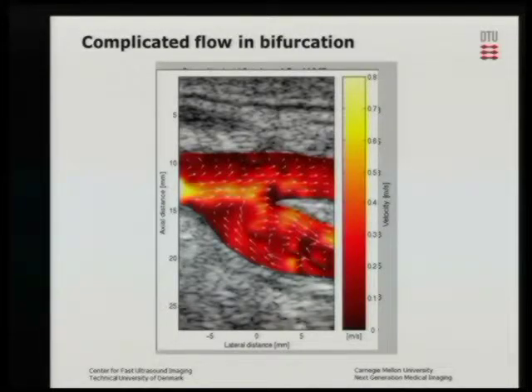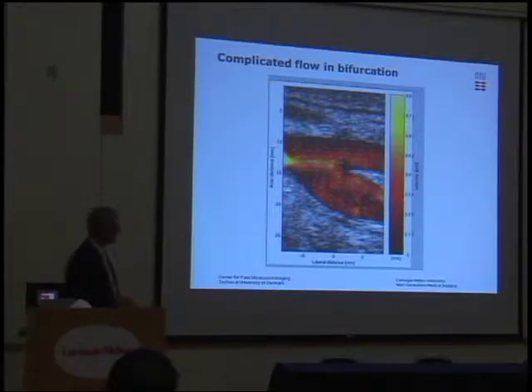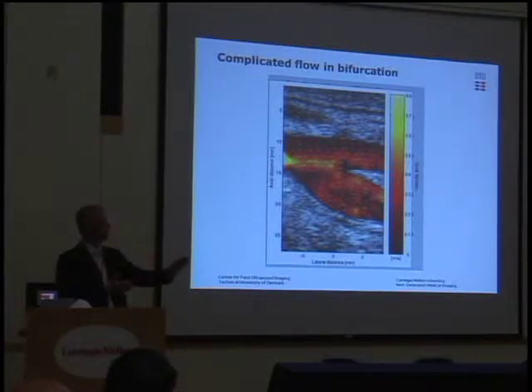So you see you have a fairly laminar flow on the top, and you have the vortex on the lower branch. And the problem of looking at this is really that this vortex comes in the systolic phase. It appears in 100 milliseconds, and then it races down the stream at 1 meter per second. So it's in the view for a fairly short time, and that's why it gets to be complicated to look at. But now you can actually start to see what's going on.